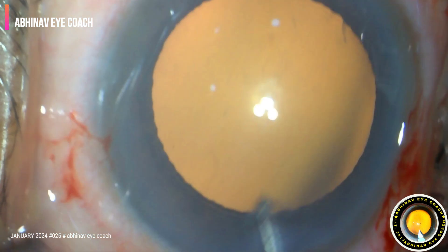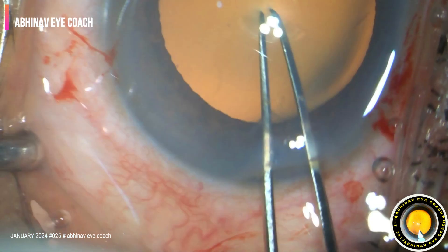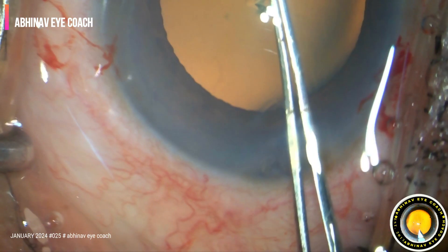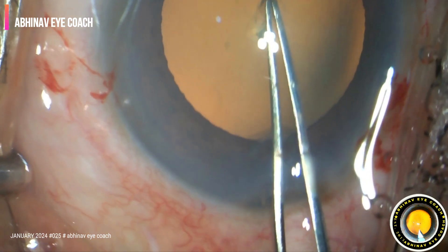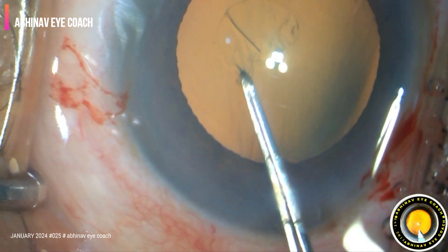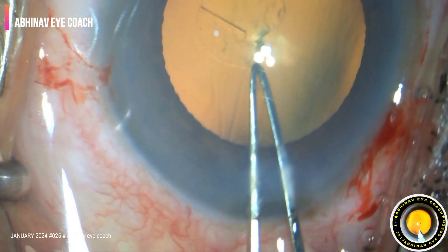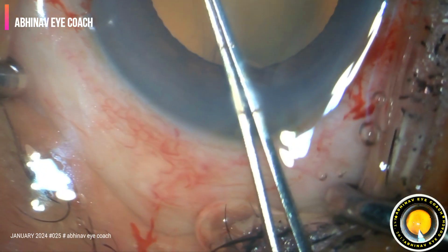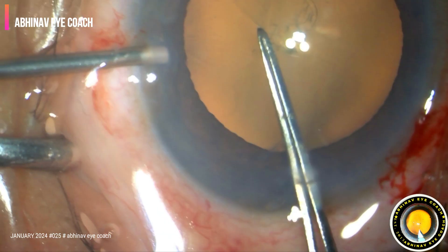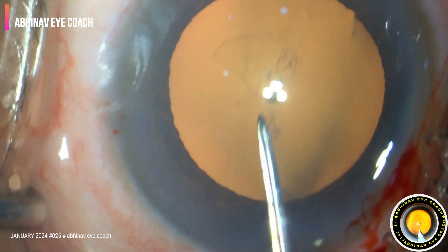The rhexis forceps is introduced. A flap is raised into the capsule, raised and flattened on itself.